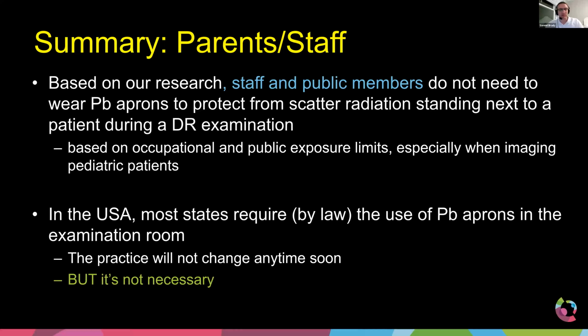One thing we have noticed, as we've talked a lot about fear of radiation, is that people that don't understand radiation fear it, of course. And so when you walk in the room and you already are afraid of radiation, and then we ask them to cover themselves in lead, it perpetuates this fear that this exam we're about to perform on one of their kids, or someone else, it could be an adult, is very unsafe. And we know in radiology that of all of the imaging that we do, x-ray imaging is probably one of the least risky. It's so low dose, so low dose.